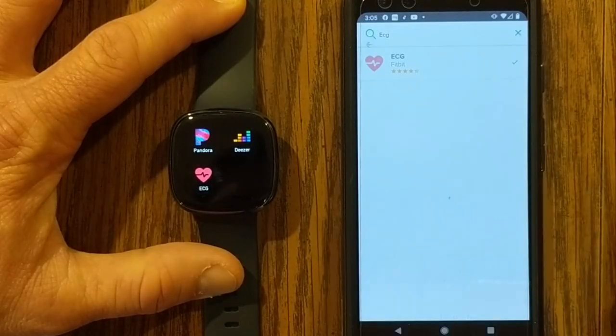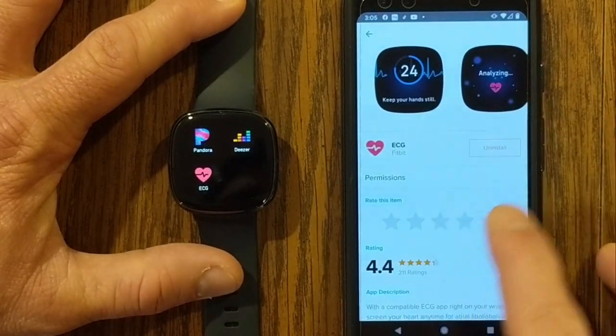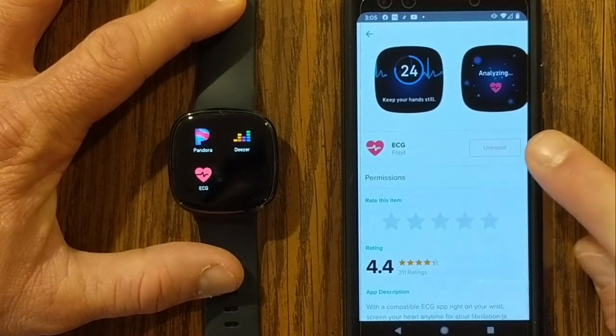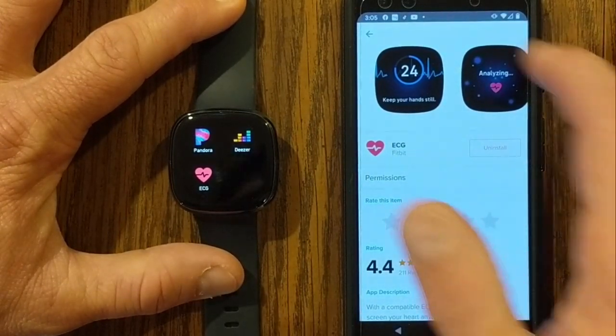There it is — ECG. If I click on that again, it takes me back to that menu showing that it's installed, but if you didn't have it installed, this would say install. You click that, and that will install it onto your watch.